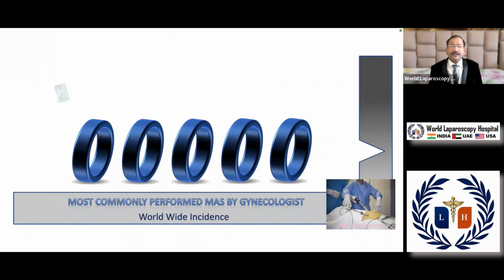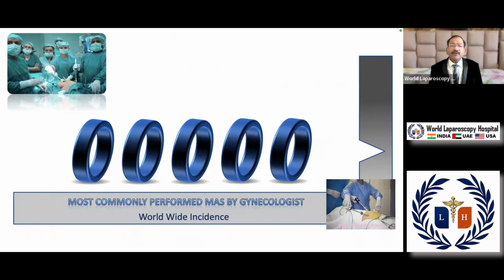Coming to the gynecologist, the most frequently performed minimal access surgery by gynecologists is diagnostic laparoscopy. Every day 120,000 diagnostic laparoscopies are performed all over the world, and the maximum number is performed by gynecologists for infertility cases.